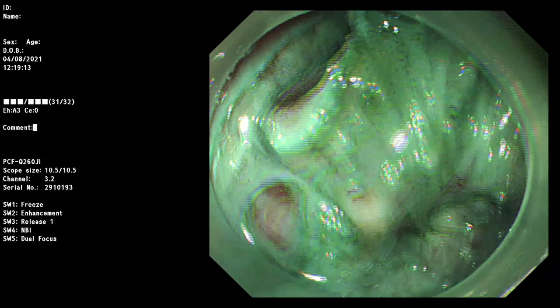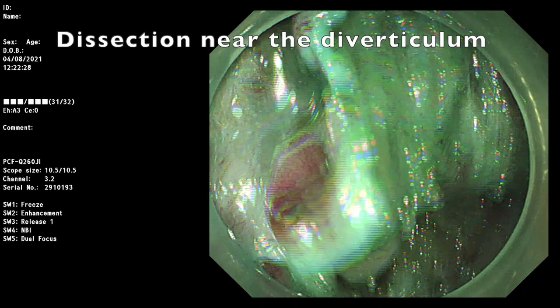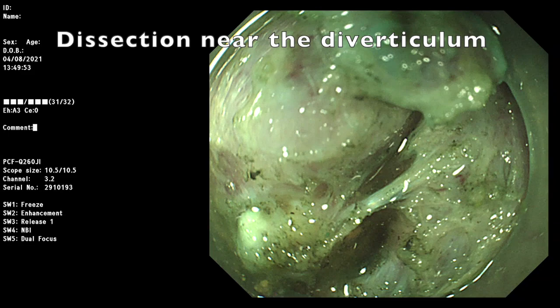Dissection of this area should be very careful to overcome the severe fibrosis near the diverticulum. By this traction method, we can clearly see the margin of the mucosa flap and the diverticulum.